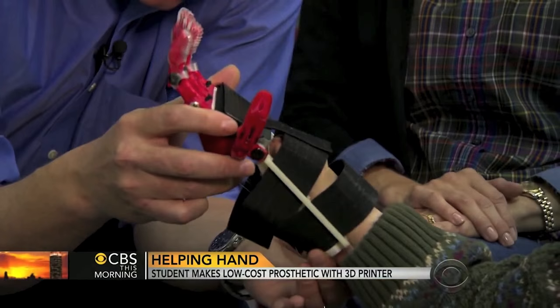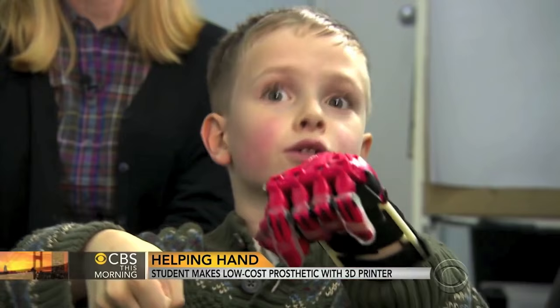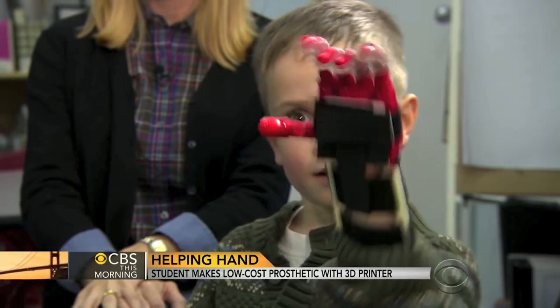Ask first-grader Holden Mora how his new hand works, and he'll be happy to demonstrate. When I bend my hand like this, it closes. When I bend it this, it opens. At seven years old, he's become an expert on the workings of this novel device made out of plastic for roughly $20.